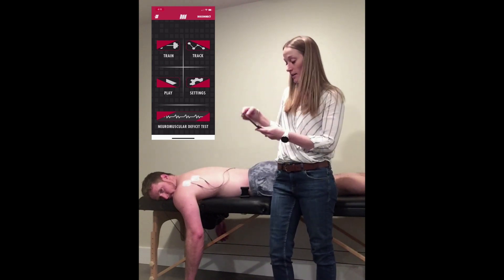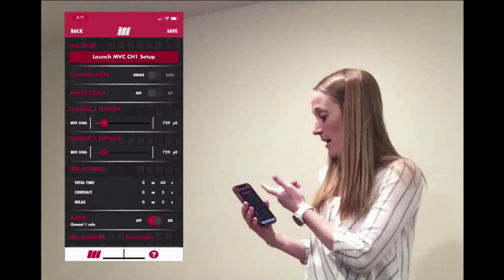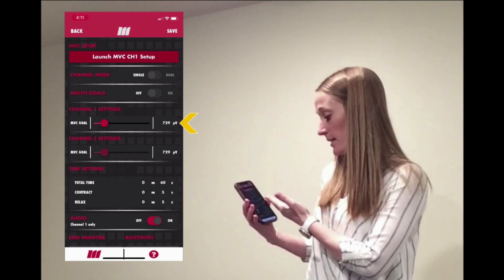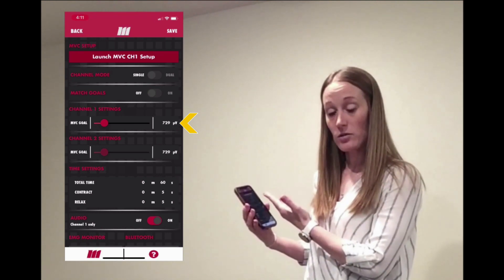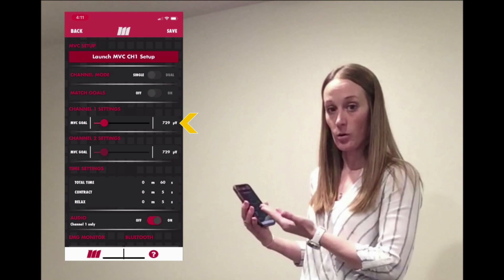To start, I go into my device and into settings. I have it on single channel for the exercise today. My goal is set to about 700 — that's where I'm going to receive audio feedback. So if I wanted audio feedback at a higher or lower goal, I would adjust accordingly.